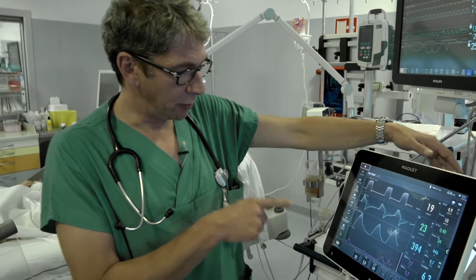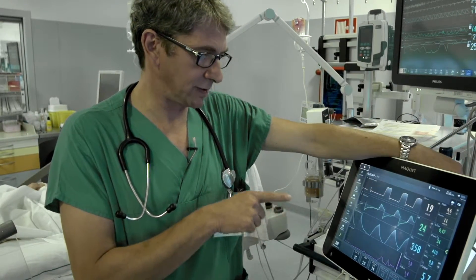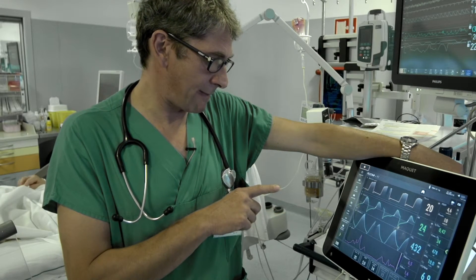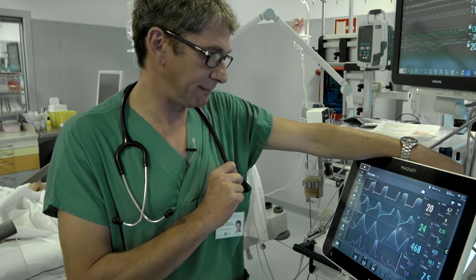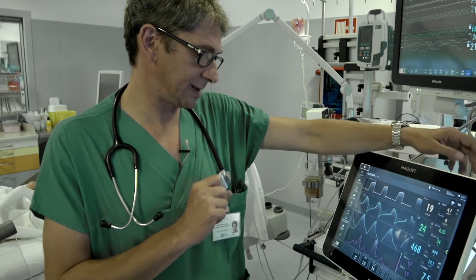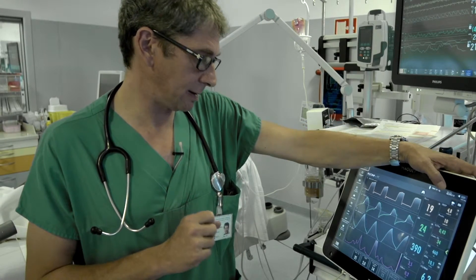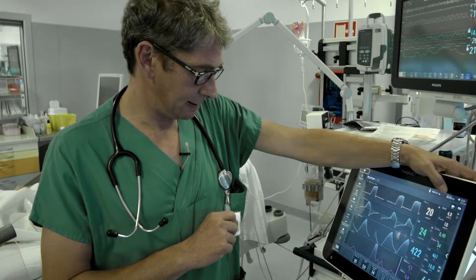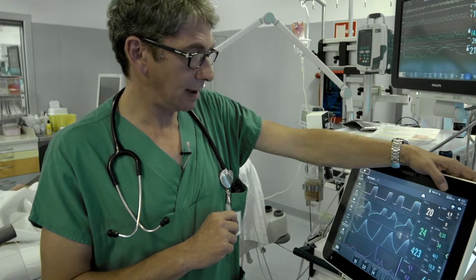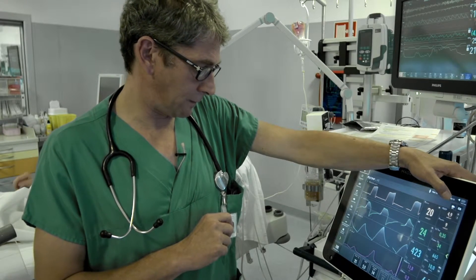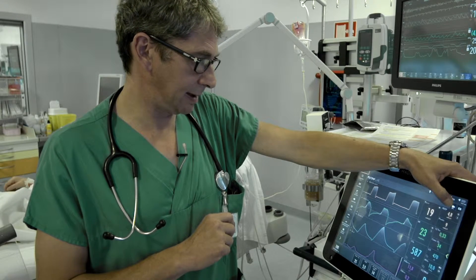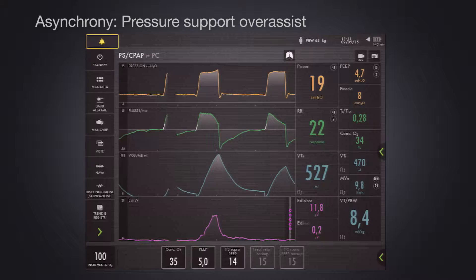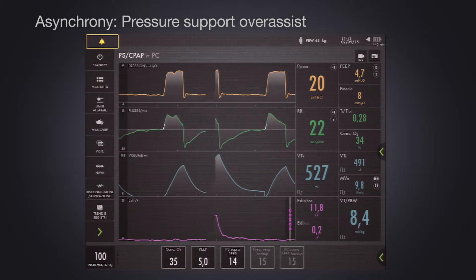Now we can try to record, with a high pressure support level, whether we can see some asynchrony with this patient. Let's wait a moment and look at the EDI signal to see if we can see something on the EDI curve. Okay, recording.